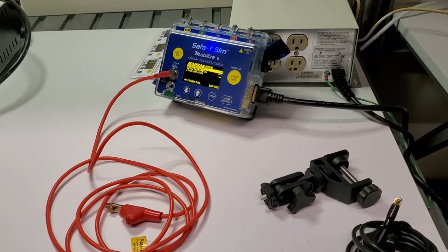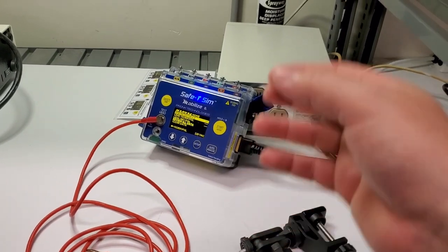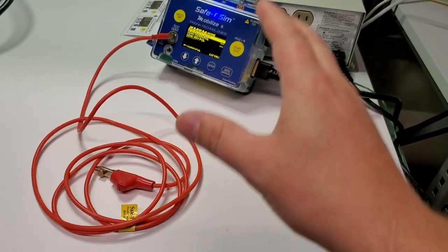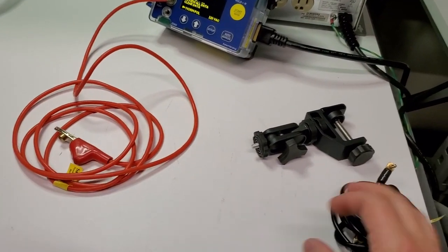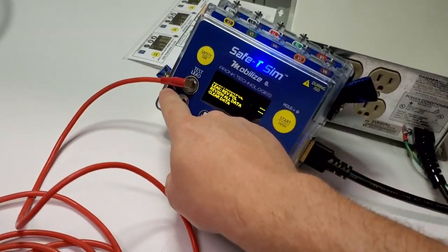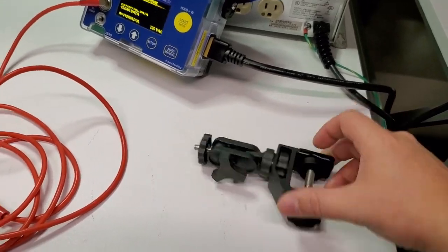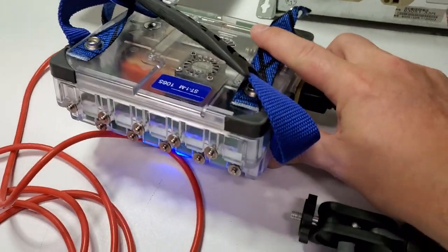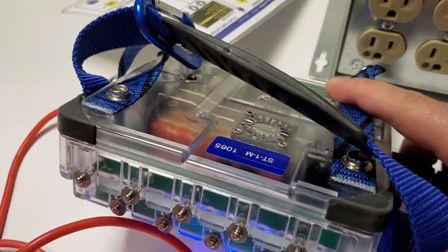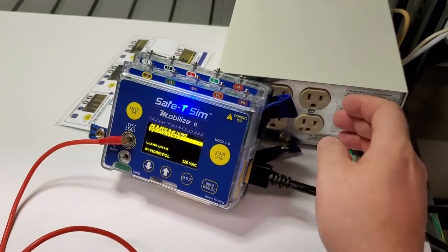Hey guys, welcome back to Better Biomed. Today I'm going to go over the Safety Sim from Pronk Technologies. This is their fully automated electrical safety analyzer. As you can see in the box, it comes with a red lead and black lead for doing point-to-point — they connect right to the front. I also have a clamp that connects to a quarter-20 lug, and there's a carry strap that's part of the electrical safety unit.